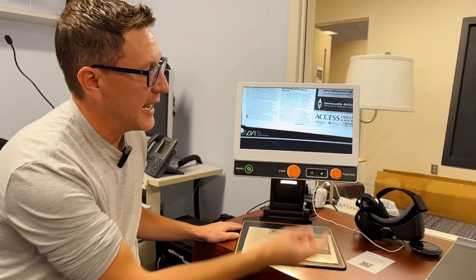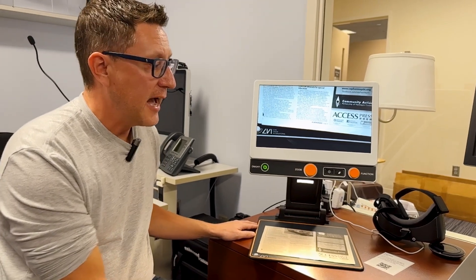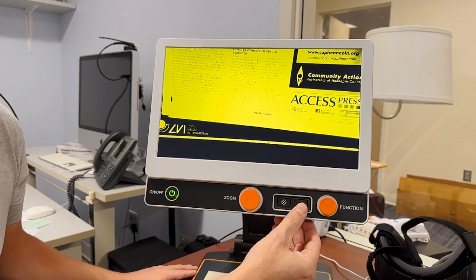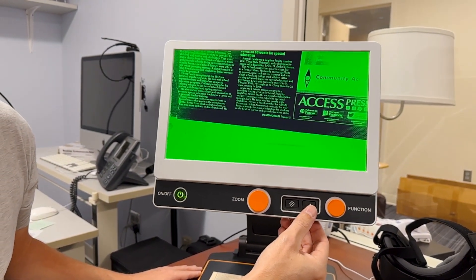What's really cool is it has the ability to put contrast onto it too, so you can add like a blue on yellow, or black on white, yellow on black — different types of contrast that might help you see that text a little bit better.